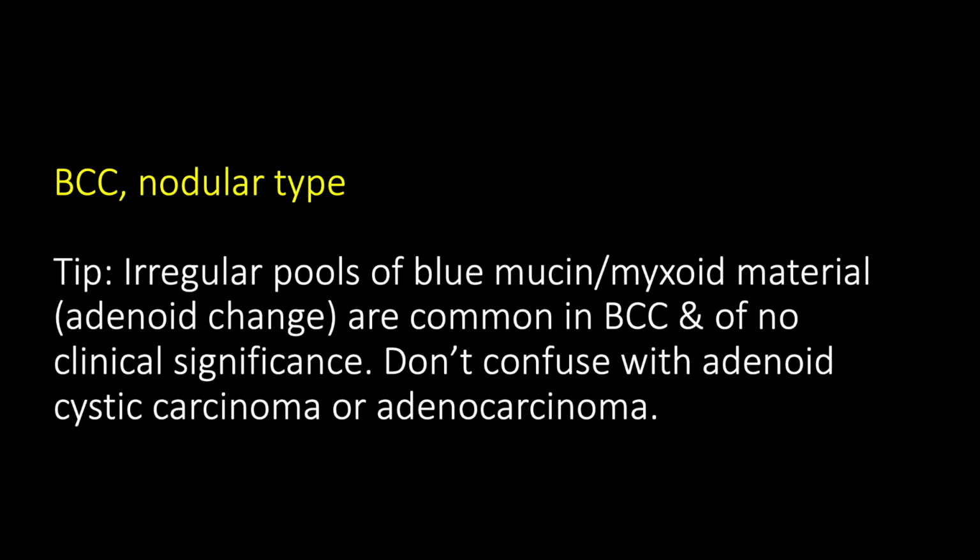It's just a pattern for pathologists to recognize, to know this looks funny, but it's totally just a normal variant of basal cell carcinoma. There's nothing special clinically about these to my knowledge. The only time I really mention it is if someone had sent me a case in consult. I don't take consult cases anymore, but I used to. And when I did, if someone sent it to me saying, oh, I think it's adenoid cystic carcinoma or adenocarcinoma, then I'd tell them, no, this is just the adenoid pattern of basal cell carcinoma.